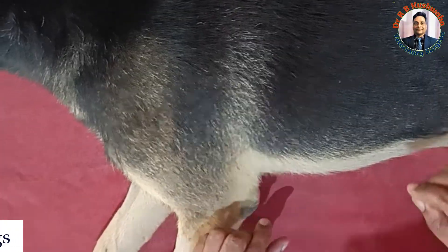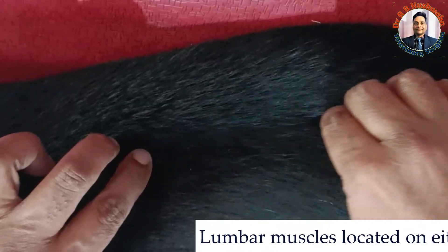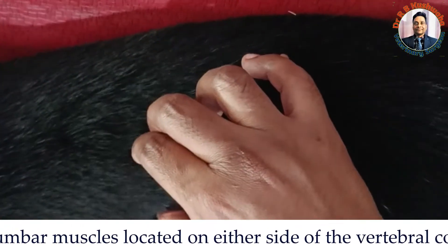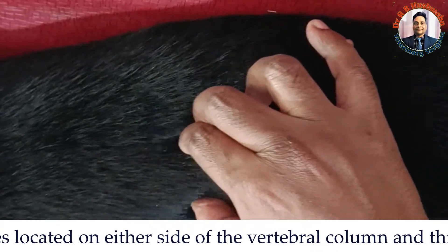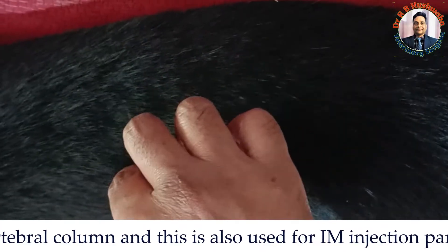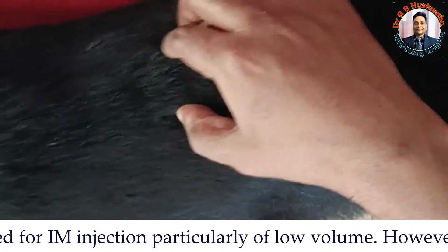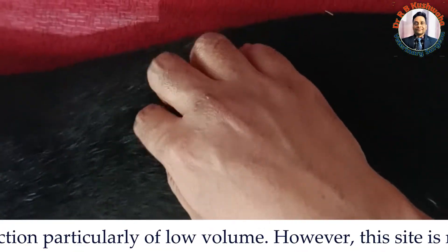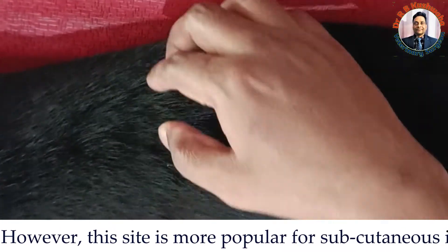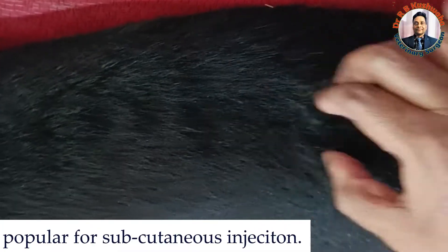The fourth site for intramuscular injection is the lumbar muscle. This is the vertebral column, and on either side of the vertebral column are the lumbar muscles. You can give the injection directly here in the lumbar muscle, very close to the vertebral column. However, the volume of injection here should be less. This area can also be used for subcutaneous injection, but intramuscular injection can be given here as well.